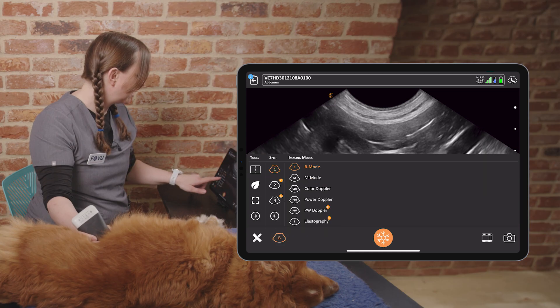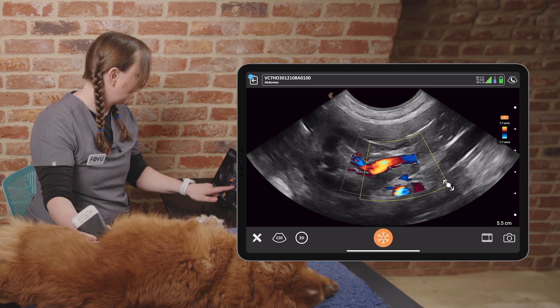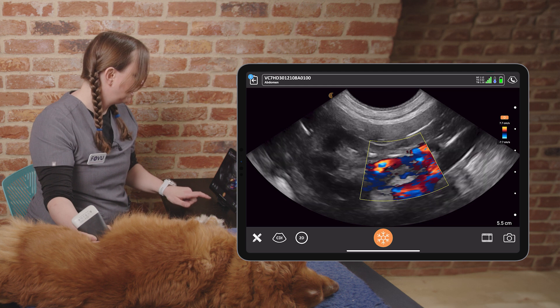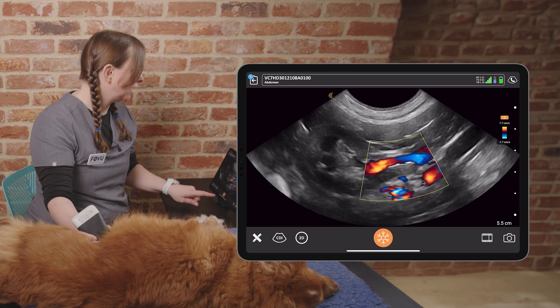We can also apply colour flow mapping on the region to help us understand the vasculature — see those renal arteries, see the aorta and the phrenicoabdominal vein.